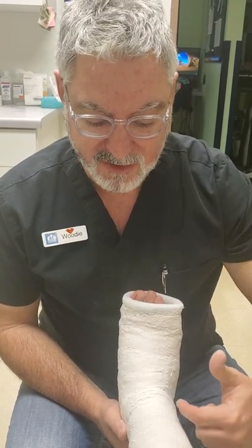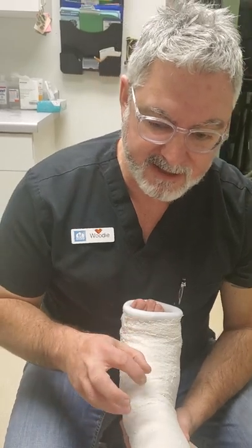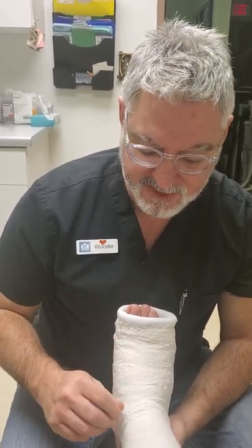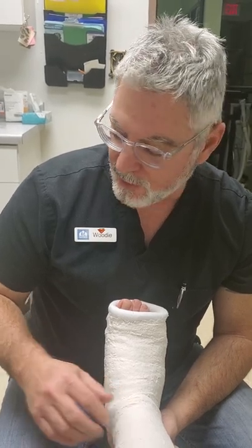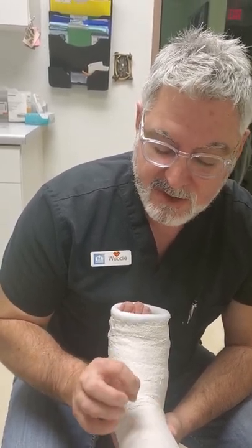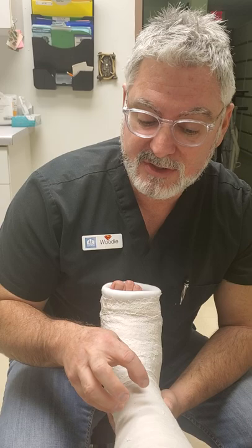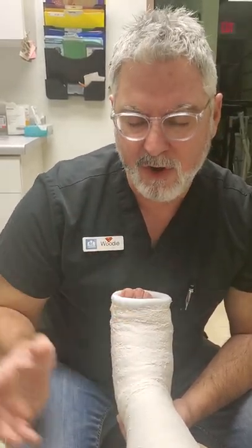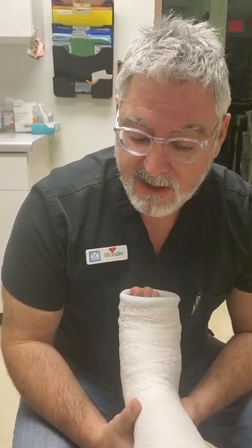You could cut through the plaster with what they called cast scissors back then — a little bit more rugged than the scissors we have now. The different ways to soak it off: you can soak it with warm water, warm water and vinegar, or even warm water and fabric softener. As you look around YouTube for removing plaster casts, there are other home remedies, but those are, in my opinion, the most common ones I've read about and have been told by parents are the most successful.